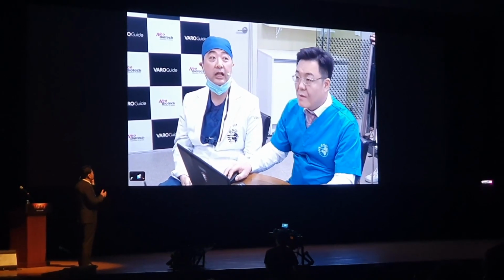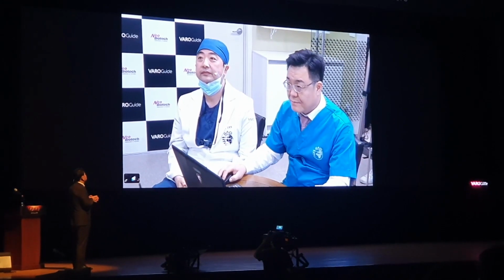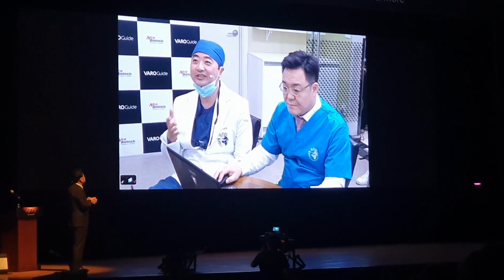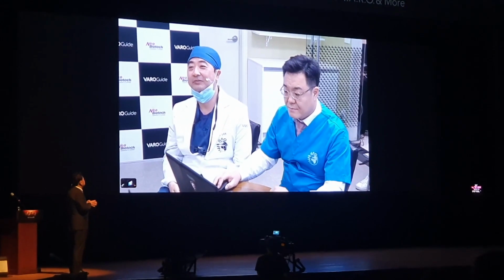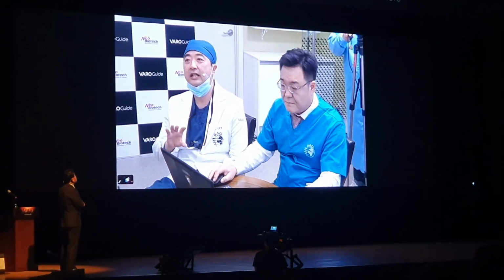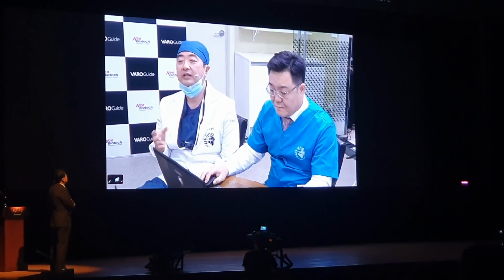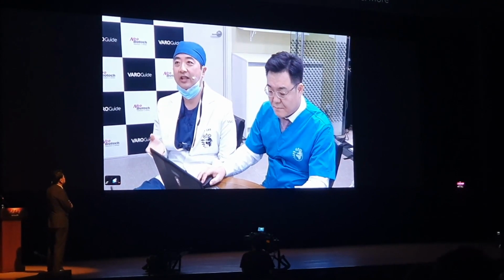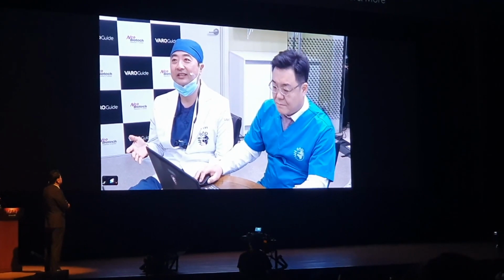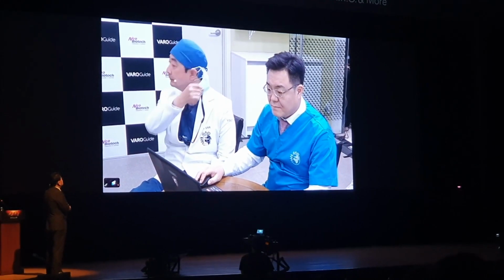So everything needs a learning curve. Everything needs a learning curve, sure. I watched Dr. Ho's lecture right here on the screen, and I agreed that in comparison to the existing guides, such great shortening of time is a huge advantage. So another thing is that there is no need for impression or model making or intraoral scanning, etc. So this is a fully digital method. This way it'll make it easier to understand the system. Yeah, because we don't need the scanning, right?